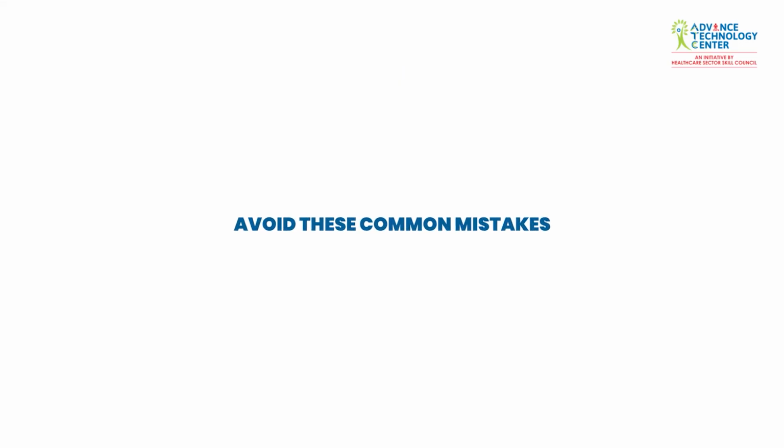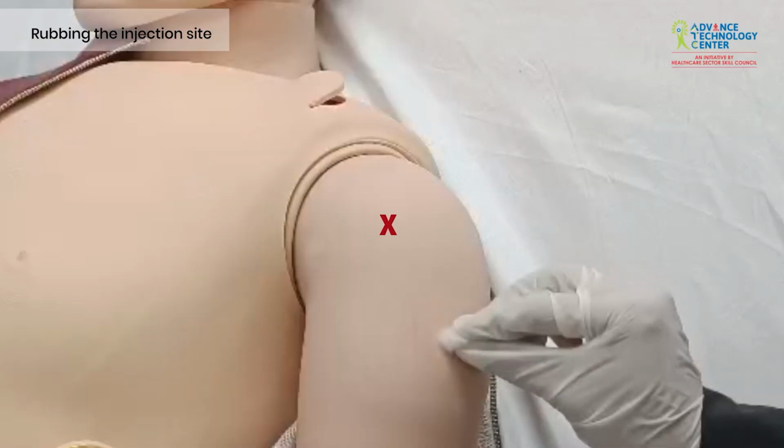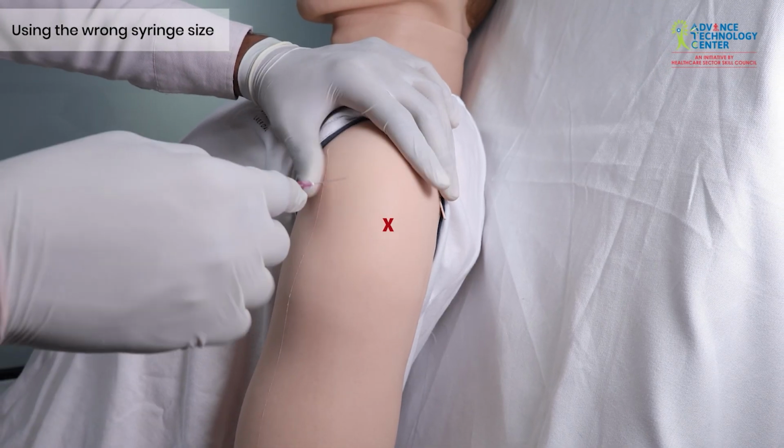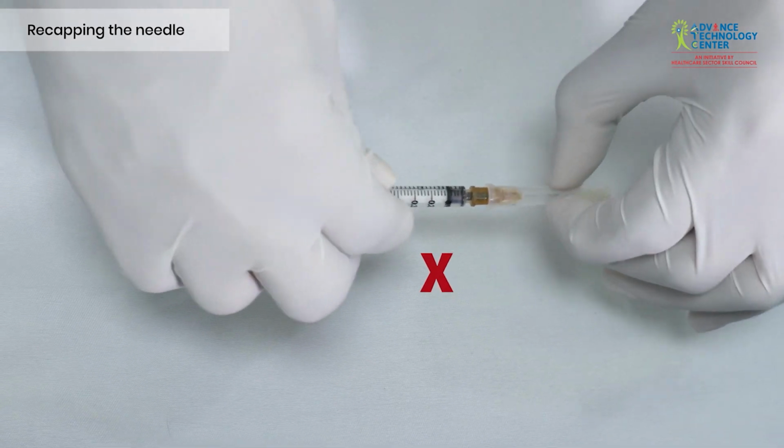Avoid these common mistakes. Incorrect needle angle or site selection. Rubbing the area aggressively after injection. Using an inappropriate syringe or needle size. Recapping the needle after use. This increases needle stick risk.